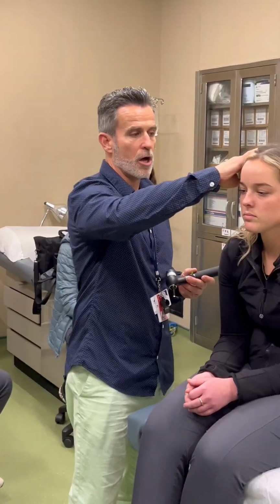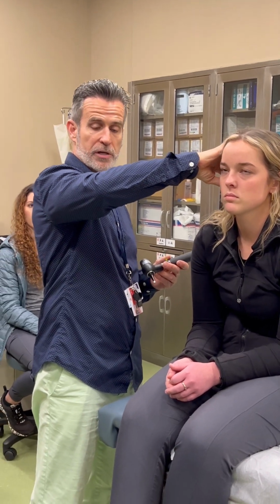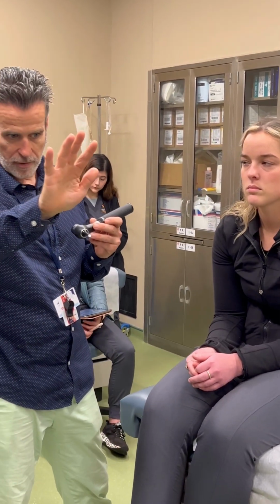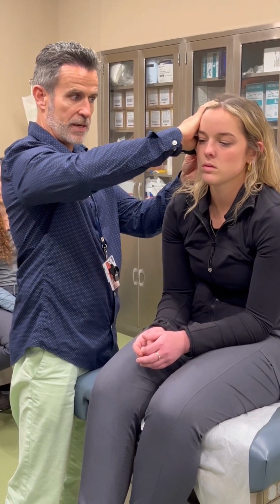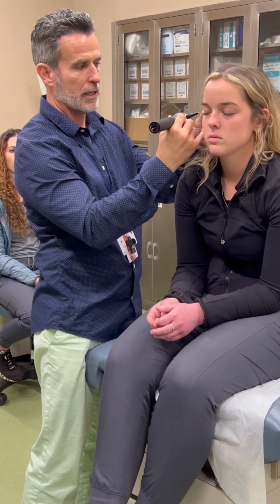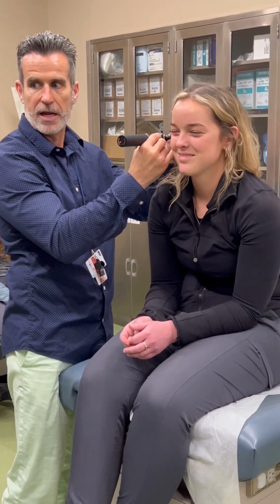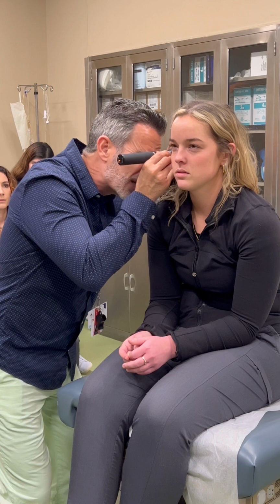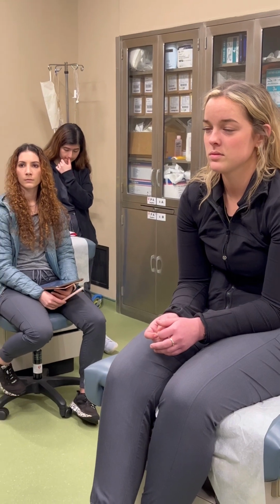All right, so up and back for adults. You want to do posterior and down for kids. So here again, there's a couple ways you can do this. I'm going to do it on both sides, so don't panic over there. So if you do it back like this, you better have your palm down to where her face can't turn. Everybody see that? But the way I prefer for you to do it is to hold the ear up and back, get your thumb or pinky finger like that. So she turns, try to turn, Grace Anna. She can't turn, okay? She's hitting my finger. I'm putting resistance on it. And then you want to go down, you want to pull back a little bit, and then look at the ear. I'm observing the condition of the external canal.